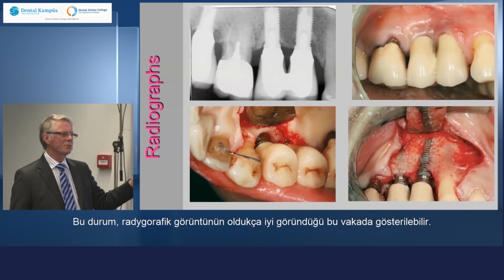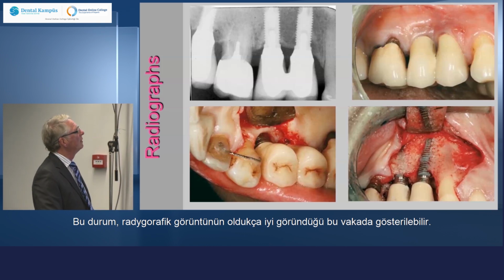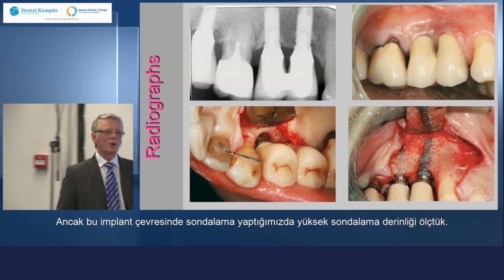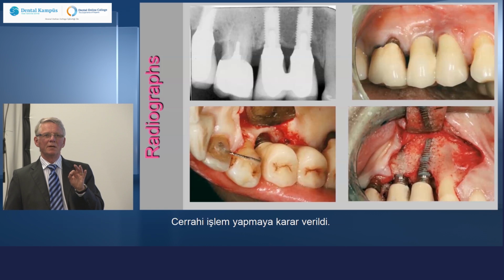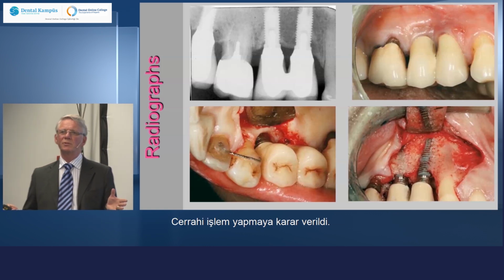And this could be demonstrated also in this case, where the radiograph looks fairly good. But when we did the probing around this implant, we had some deep probing depths. And it was decided to make a surgical procedure.